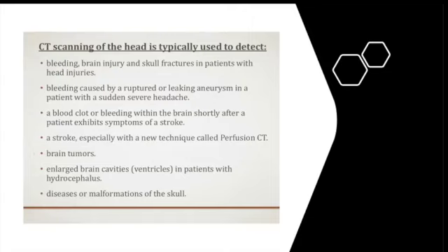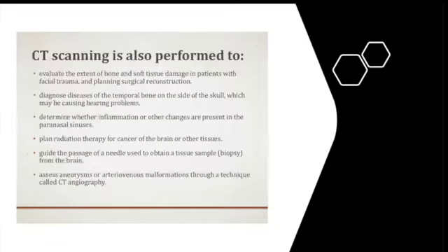If you are considering strokes and you want to exclude hemorrhagic causes of strokes, or if you're suspecting hydrocephalus, especially in a child, any diseases and malformations of the skull, then these are all good indications for you to order a CT. There are also some extra indications for a CT.